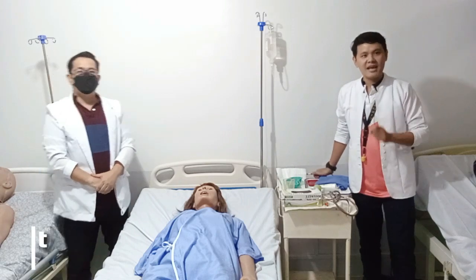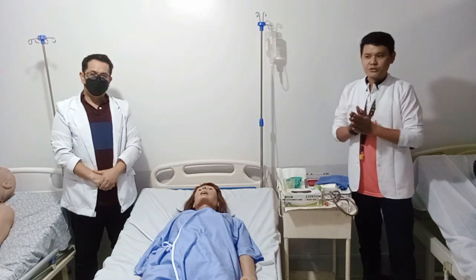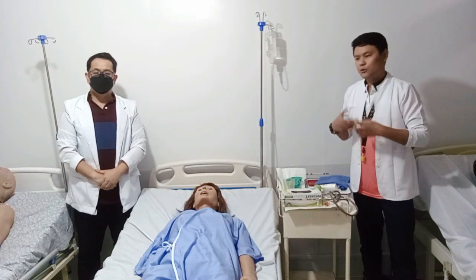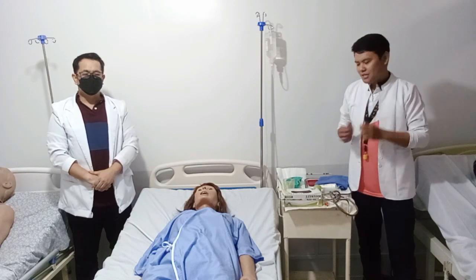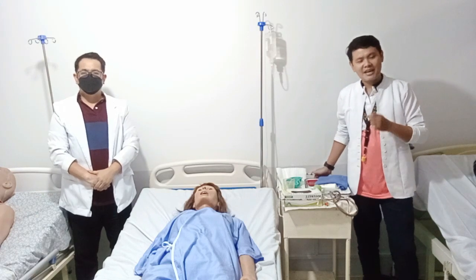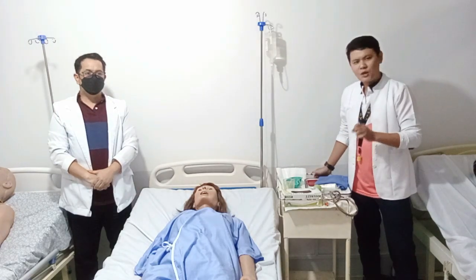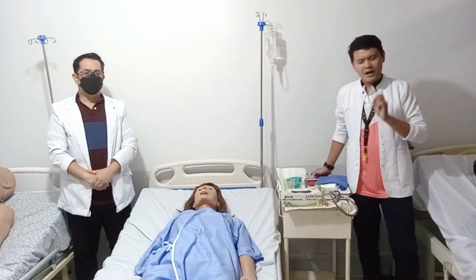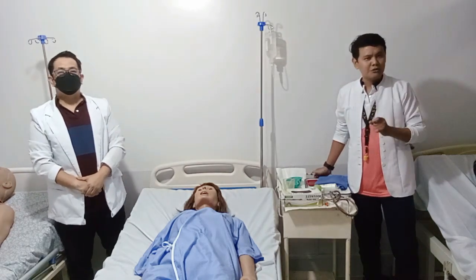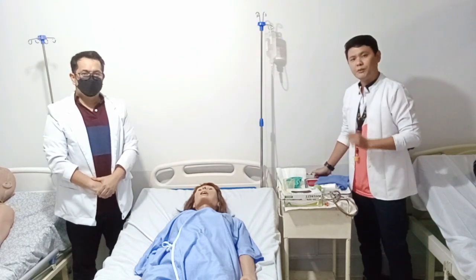First things first, we need to make an assessment. Assess for the doctor's order, because this procedure depends on the order of the doctor. We also need to check for the client's LOC, or the level of consciousness, and also the knowledge and understanding of our client towards this procedure. Check the availability and functionality of all the materials we're going to use. Also assess the history of nasal surgery and if our client has a deviated nasal septum. We need to check the patency of the nares, the presence of the gag reflex, and lastly, the mental status of our client and the ability of our client to participate in this procedure.